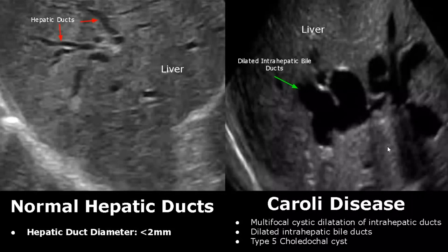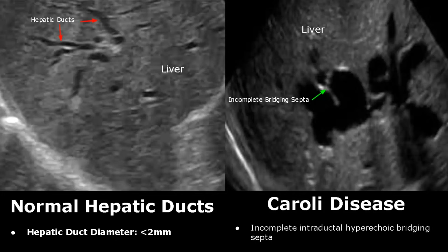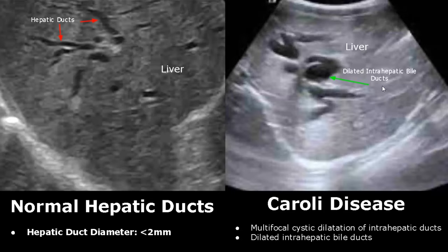Caroli disease is also congenital. There is multifocal cystic dilatation of the intrahepatic ducts, meaning these bile ducts are dilated at multiple locations. It is a type 5 choledochal cyst. Another feature of Caroli disease is the incomplete intraductal hyperechoic bridging septa. Here is another image of Caroli disease with cystic dilatation of intrahepatic ducts.